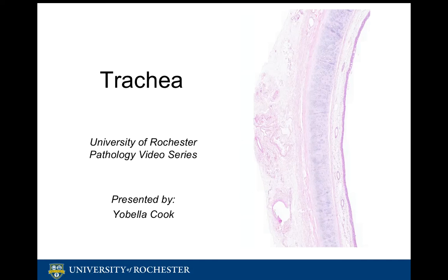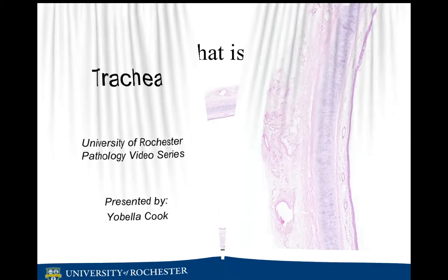My name is Yobella Cook, and this video reviews the normal histology of the trachea.